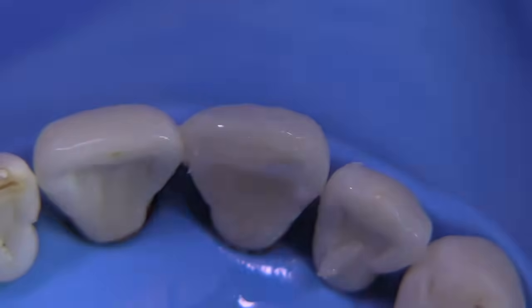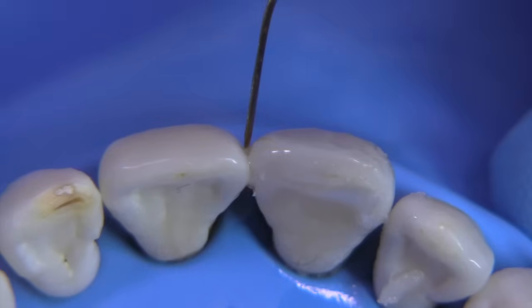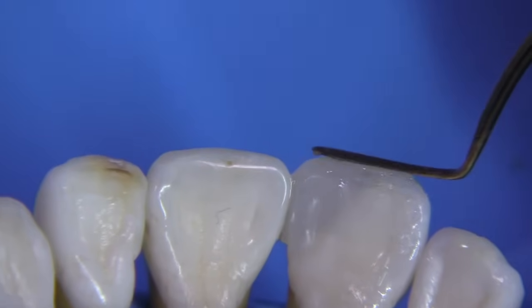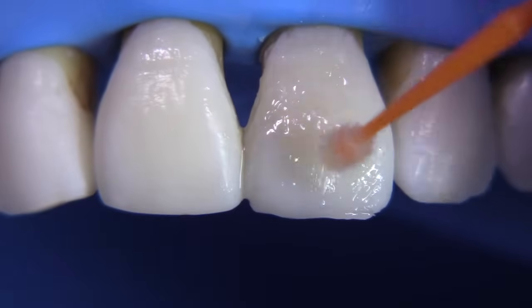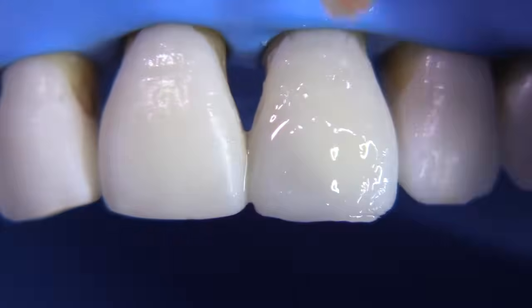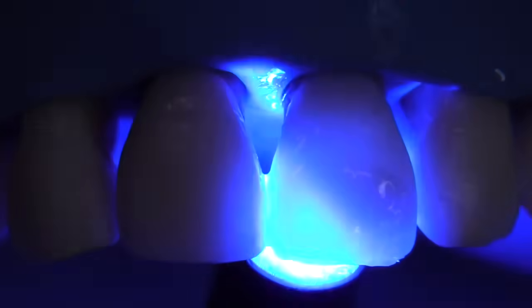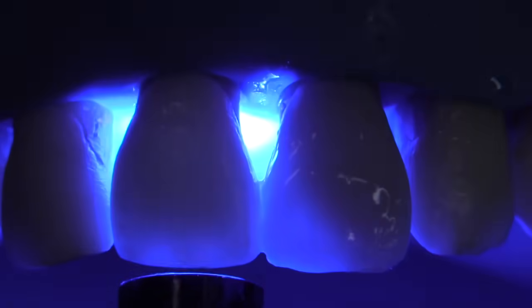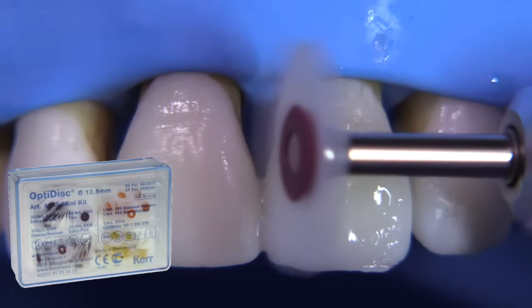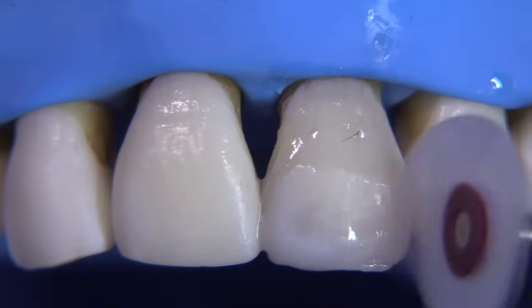I switched over to a more opaque composite. Looking at it from the incisal view — this is really the reality check view for Class 4s — you can really determine if your line angles on the mesial are correct. We can get length from the facial and basic contours and texture, but getting that mesial-facial line angle correct really requires looking at this from the occlusal view. I don't mind utilizing a little microbrush or camel hair brush, and even rubber tips, to manipulate the composite. This is a very simple approach — it's acceptable, not great yet, but it doesn't have any texture yet.